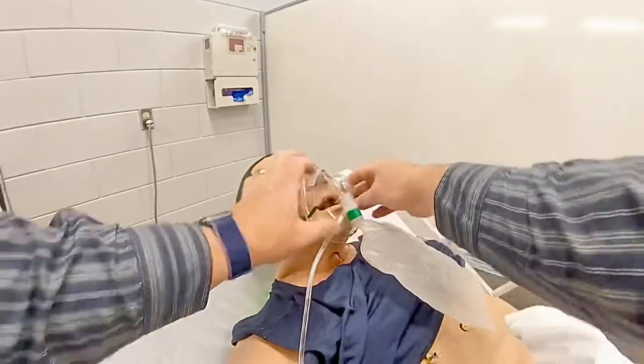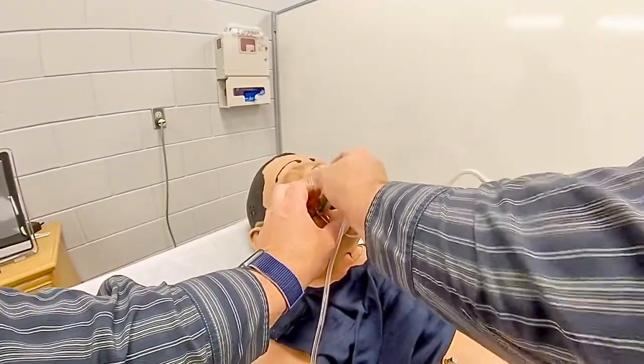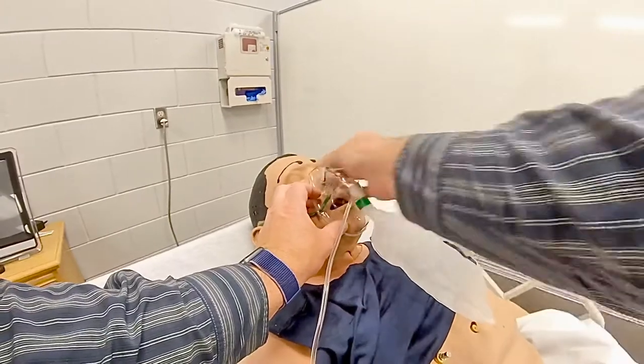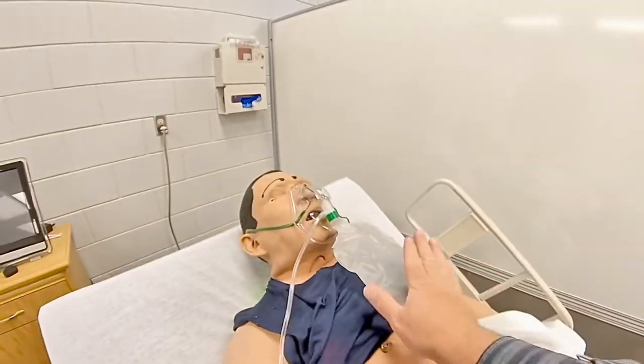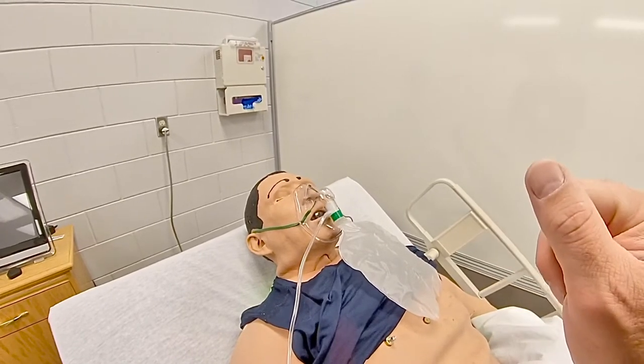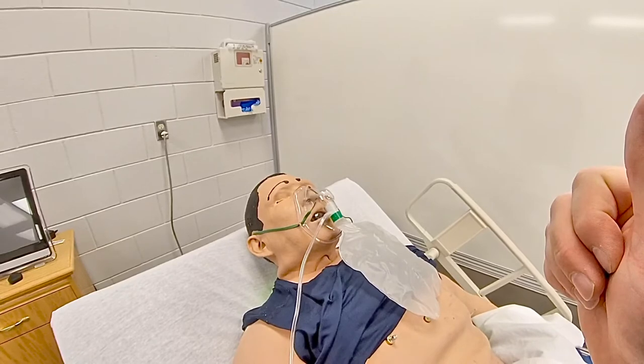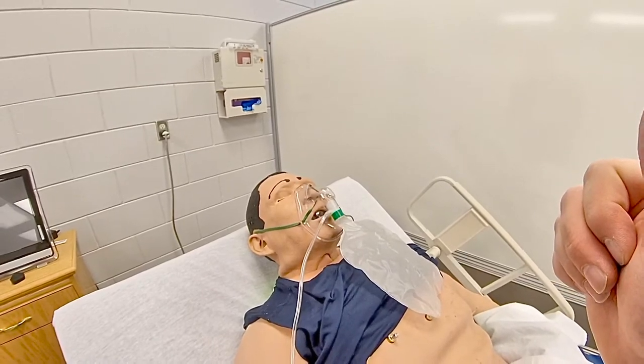You can adjust them on each side so it's snug. Pinch the aluminum part to make it snug across the nose, and then watch to make sure your bag doesn't deflate — it may deflate some, but make sure you have oxygen running, and in a few minutes you can check to see if your patient has improved.